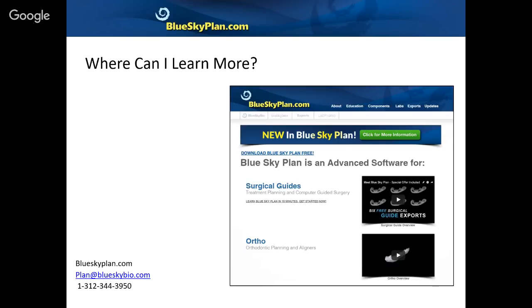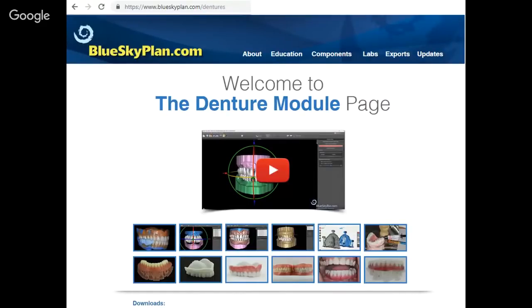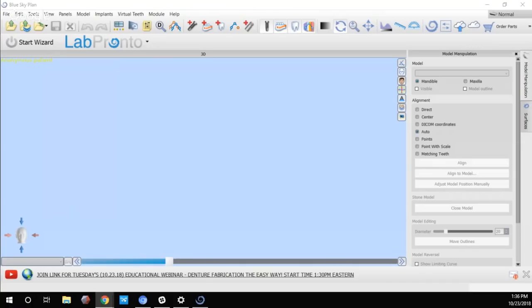Without further ado, I'd like to pass this over to Raymond to present the process flow for denture fabrication in the Blue Sky Plan software. Thank you, Michael. Hi everybody — I'll be happy to give you a demonstration of the software functionality for making dentures.